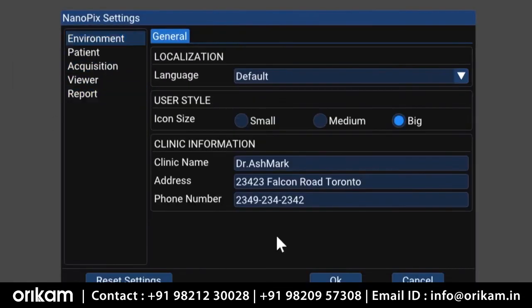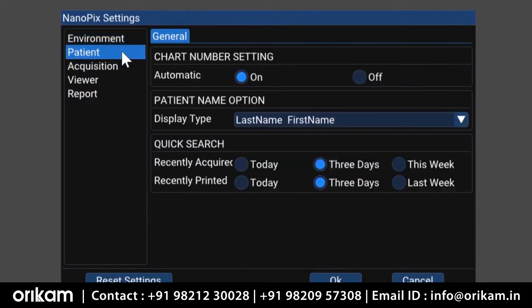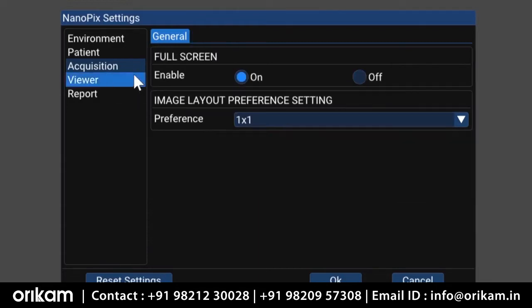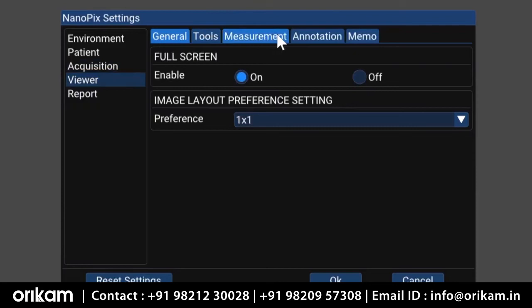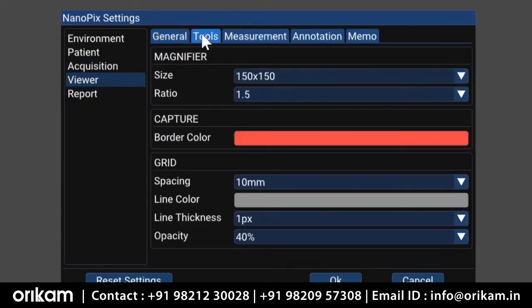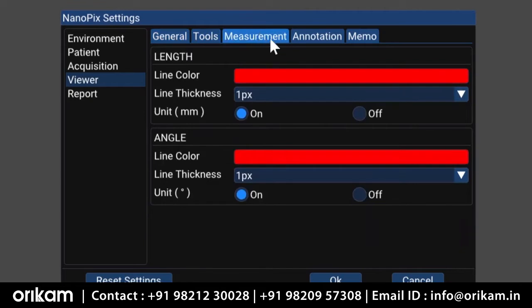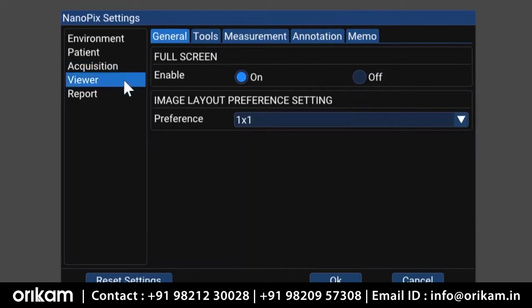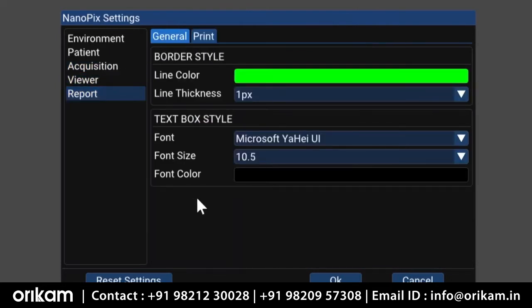There's a few things in here we can take a look at. You can set your language, clinic information — you can see there's my information. Under Patient, we can also do chart numbering and set up how you want the patient to be named. Under Acquisition, you can set up specific settings for your x-ray unit — for me, I needed to set it to AC and we have the threshold set for 100 micro grays. In the Viewer, there's a whole bunch of different tools you can use, including your magnifier, and you can really customize the way you want your software to run. And then under Report, you can really customize the way you want to use this.